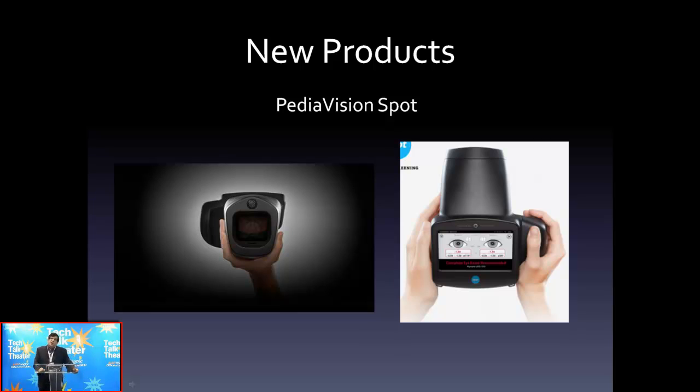There is some controversy surrounding this device. It's not yet been approved by the AAP or by the section on ophthalmology for a variety of reasons. Unlike ear screening, it has yet to be demonstrated that identifying a child with a vision problem early in their lives will make a clear difference in terms of their educational potential and ultimate IQ, etc. But I'm very excited about the potential for the PediaVision Spot. I understand that data is forthcoming, and if you see a demonstration of this device, it's truly very impressive.